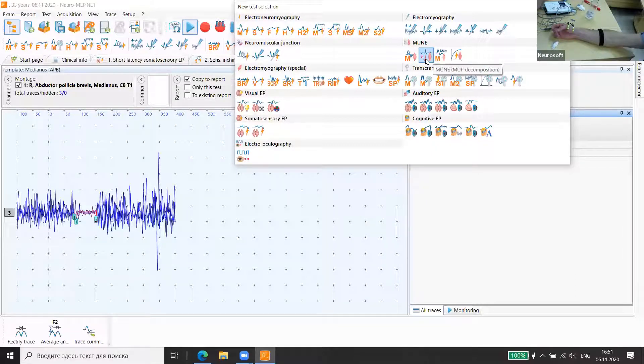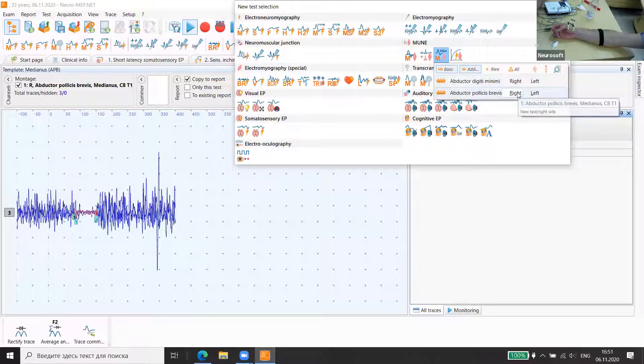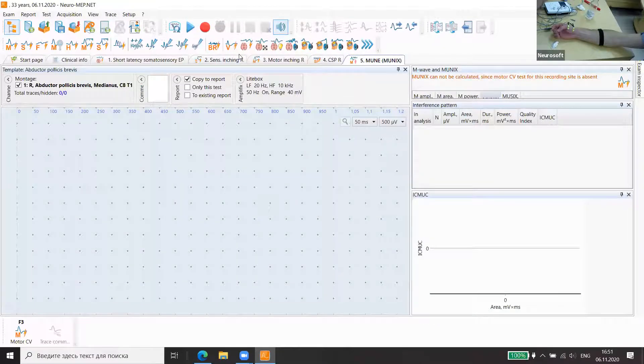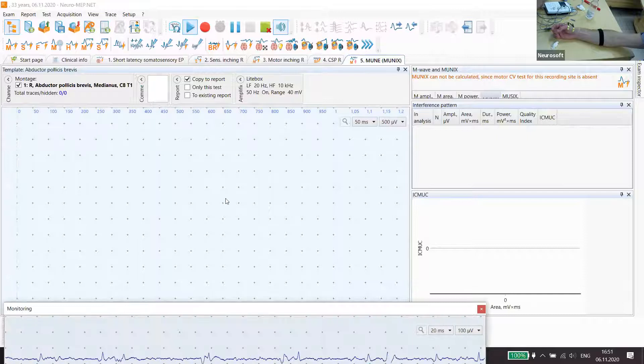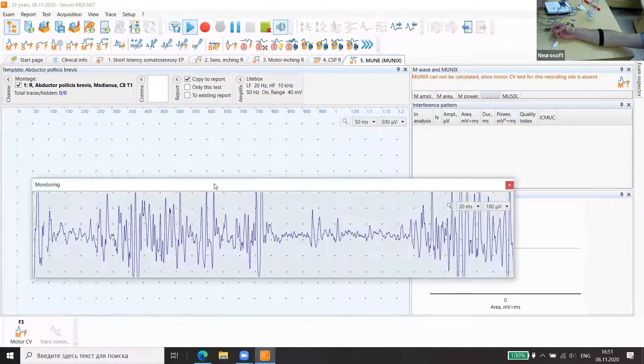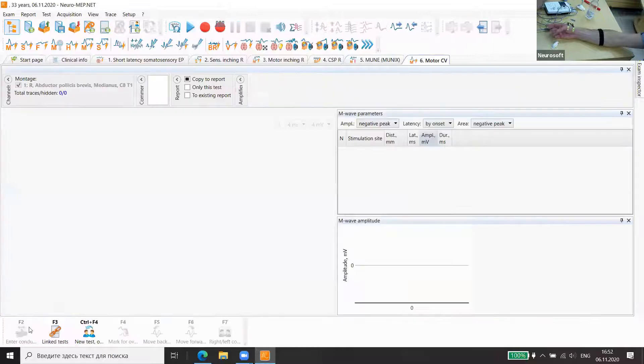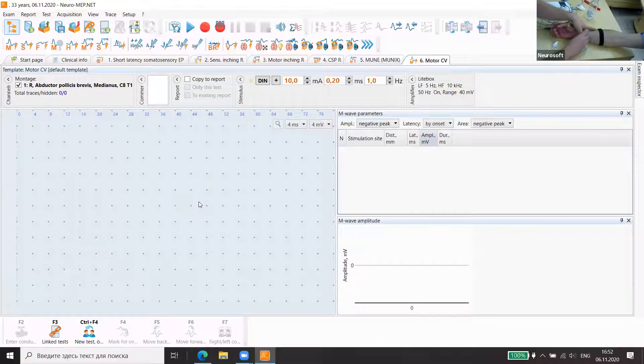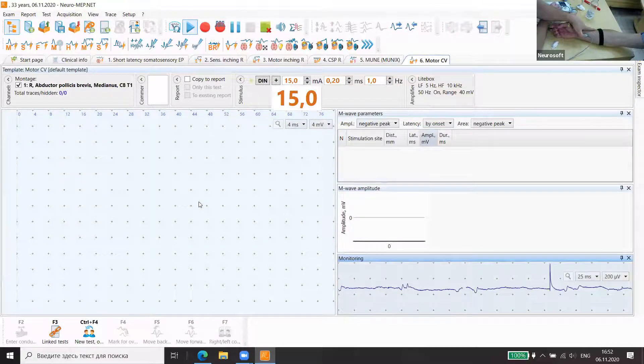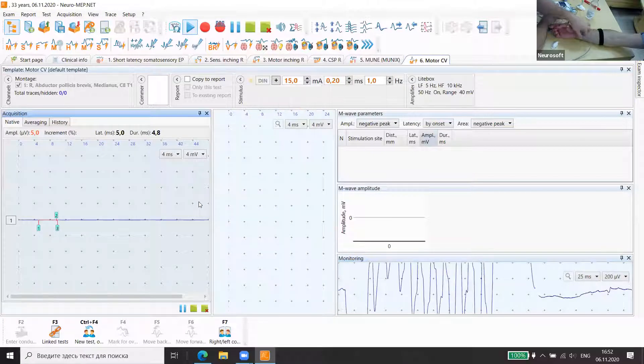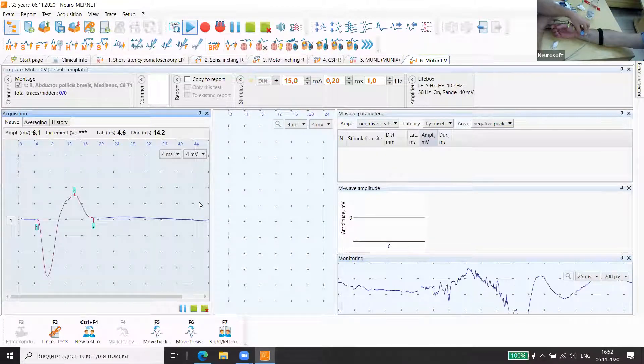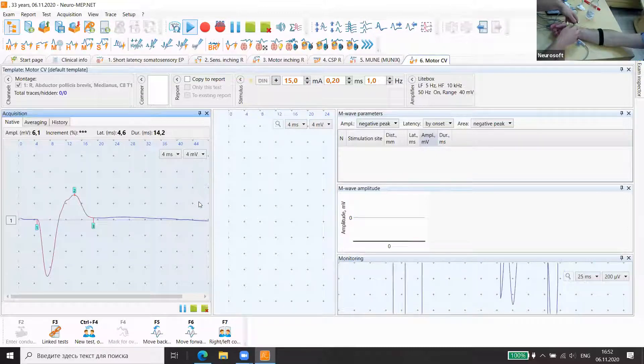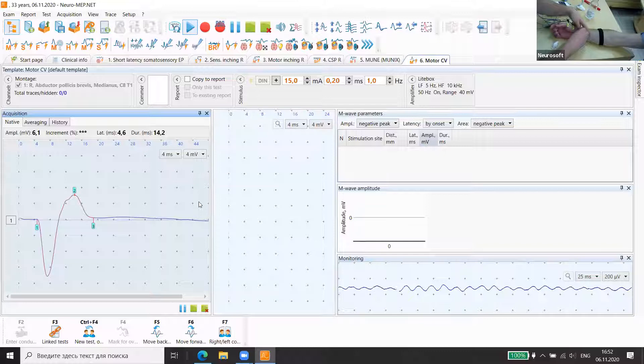We choose MUNIX abductor pollicis brevis right side. First of all, we need to go to motor nerve study and do it. All right, we'll change this tool with electrodes.